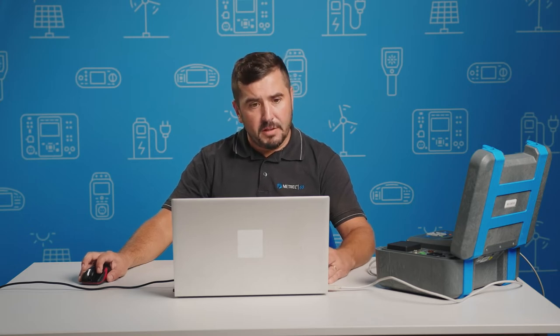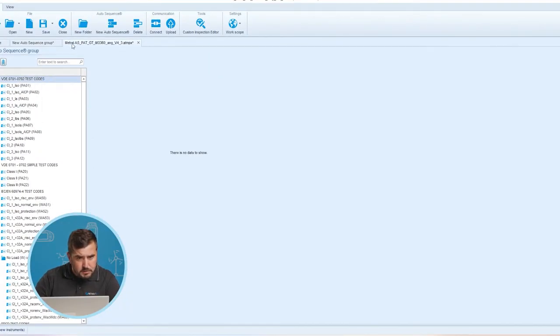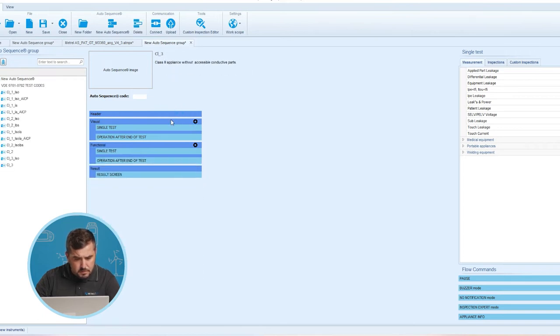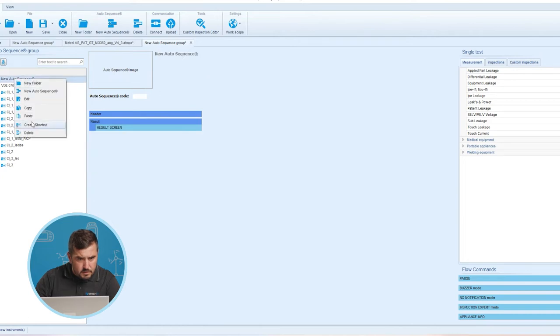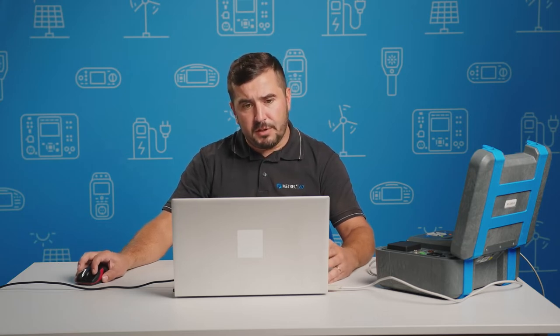Here we can see that the sequences are organized in a folder structure. We can also see that the test sequences are protected with a lock, meaning that we are not able to change parameters of these sequences directly. But if we want to create similar test sequences as the original, we can copy them into a new tab. The lock and the unique code of the test sequence will then disappear, meaning that we can modify them as we wish.